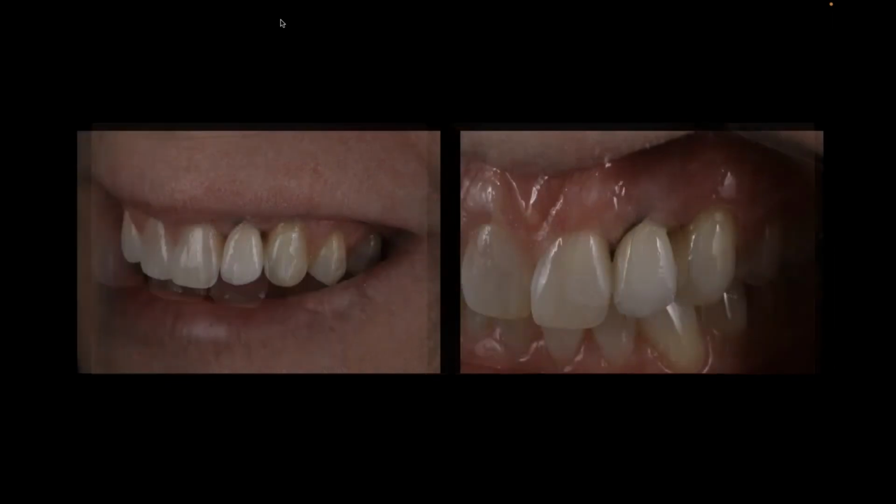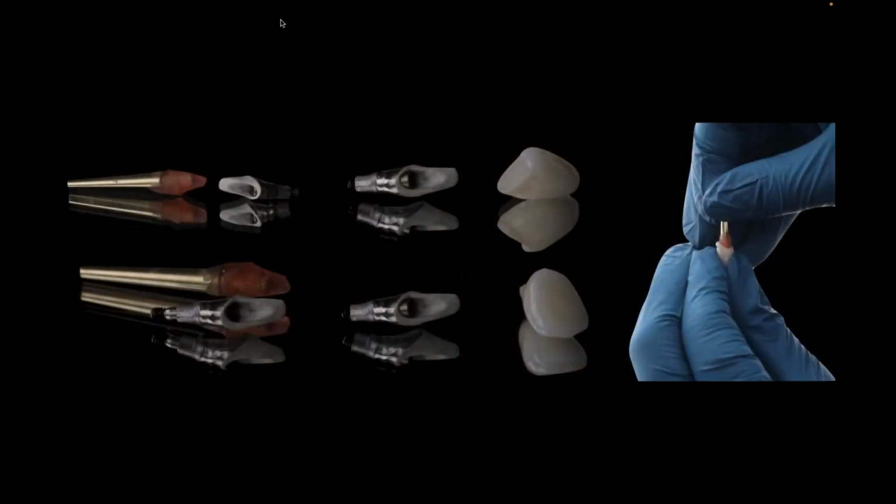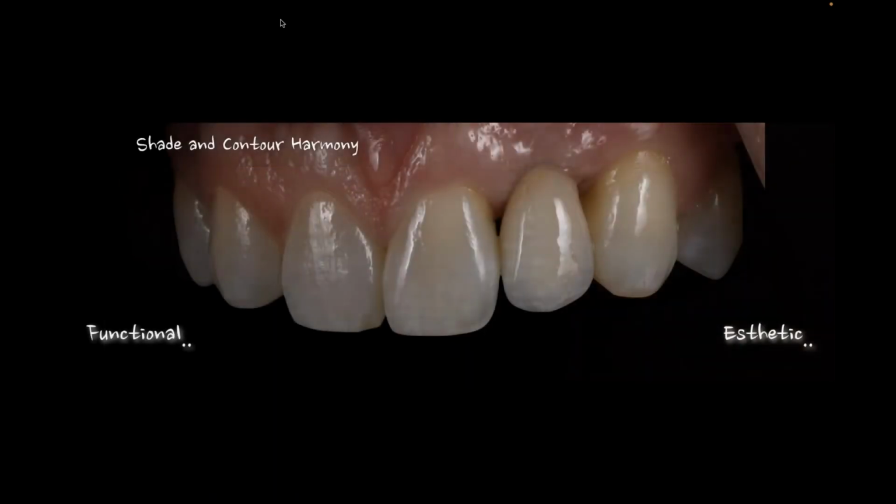The tissue changed, so I'll just come back and I'll drop that margin down to the right spot. I remade the crown. I remade the jig, the cement jig, to get rid of all the extra cement, and we remade the crown. And when I did that, what I want you to notice is that all the information that I started with is the information I finished with. What was the enamel layer that I needed? And how did I make the value behind it work for me, being that I needed to have a certain amount of translucency and a certain amount of white frosting that floated over that tooth. And that to me is really a determining factor of how we're going to make that tooth match, is to understand what that translucent layer is.